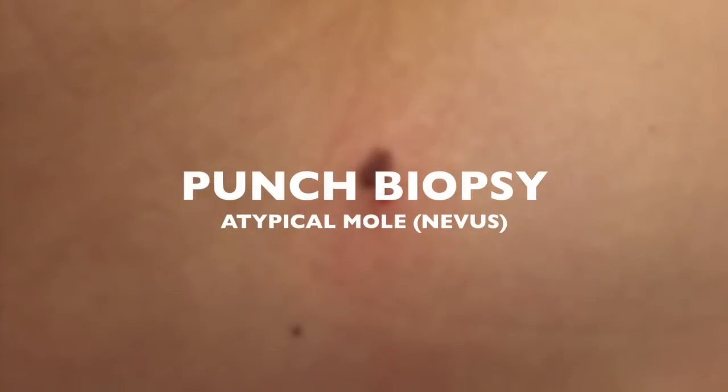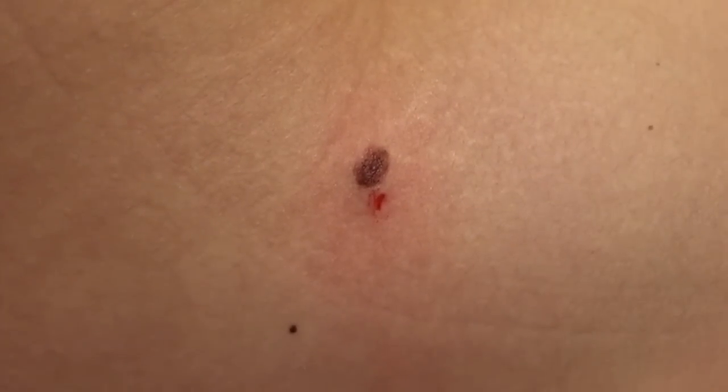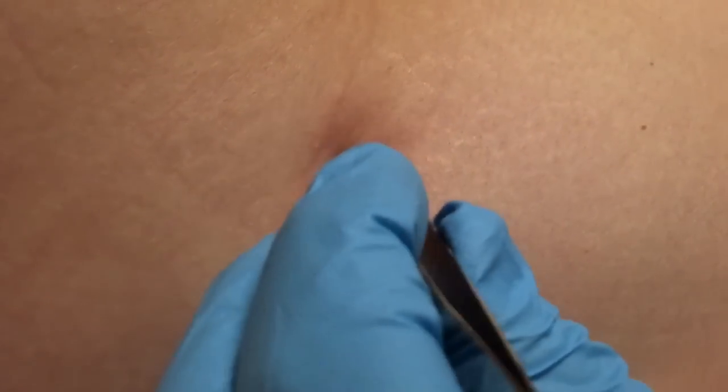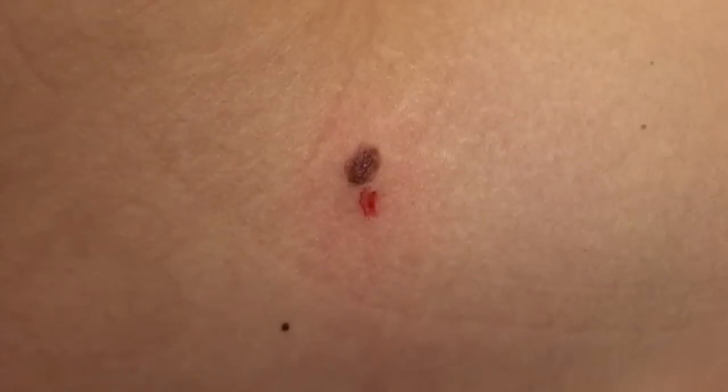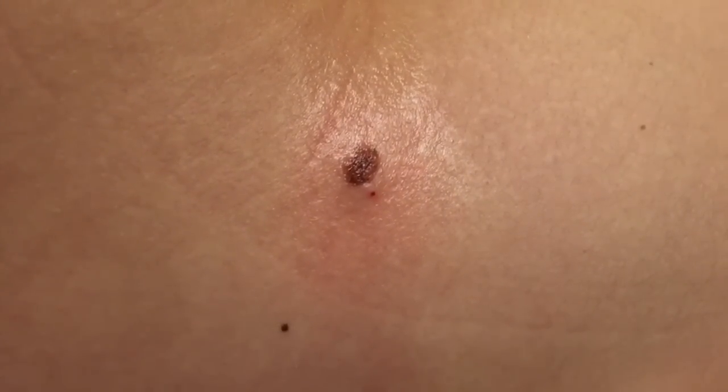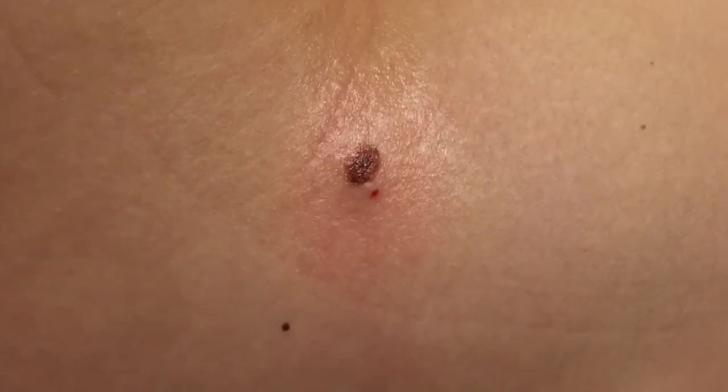We are going to do a punch biopsy of this mole because it sounds like it's changed over the last few months — is that right? Any pain? Good. We're doing it because we're always worried about skin cancer and melanoma.